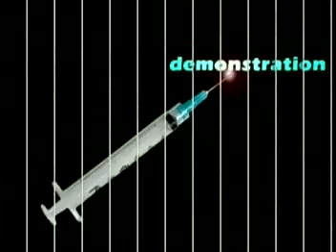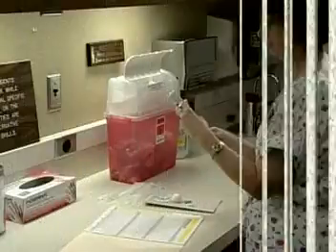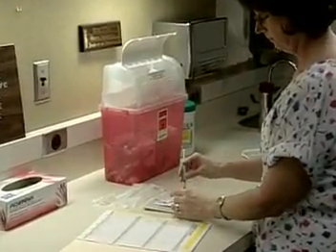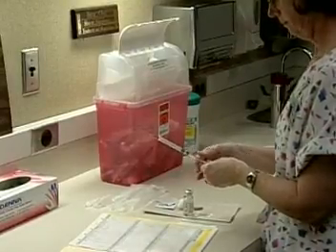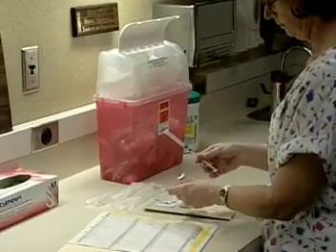Two injections will be demonstrated, one in the arm and one in the abdomen. Verify medication orders and patient allergies. Assemble supplies and medication. Draw up the medication. For this patient, 1 inch of tissue will be pinched. The injection will be given at a 45-degree angle using a 27 gauge 5/8 inch needle.